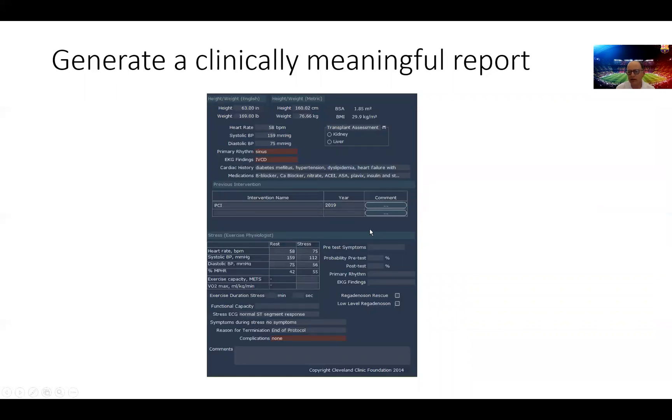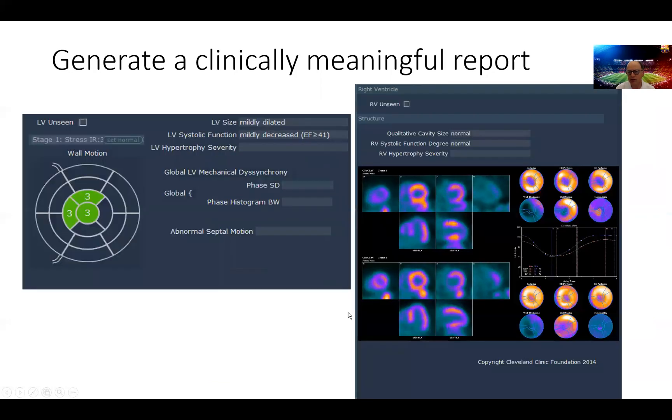But so we can see again the heart rate goes up with regadenoson. Blood pressure goes down. That's an insurance policy that the patient reacted properly to the regadenoson, to the stress agent and the patient did not have any symptoms during stress.